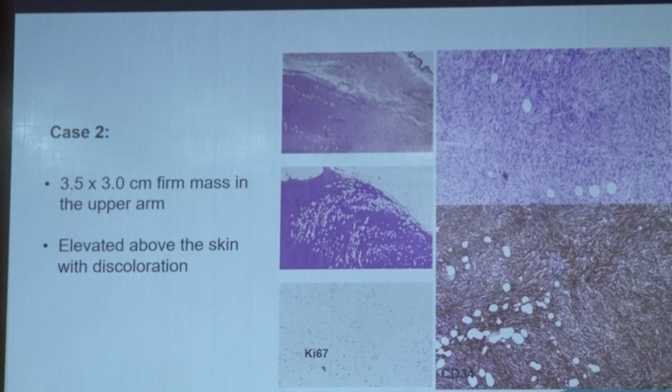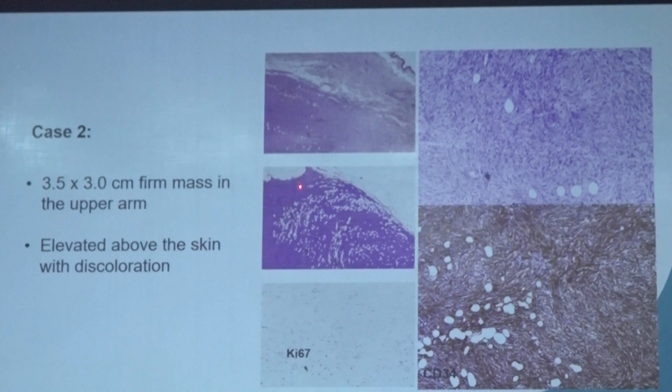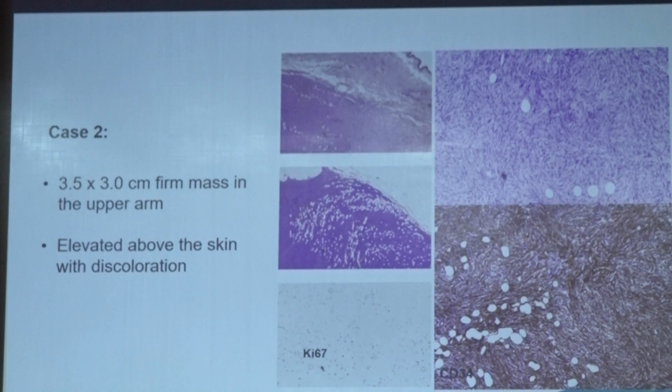Just above the Ki67, look at these two morphological patterns. So we have the skin here, and there is a grenz zone, and then there is a kind of circumscribed tumor, but not that well circumscribed. And look at the base of this tumor. This tumor had fat infiltrating into the tumor, or basically the tumor infiltrates into the fat.